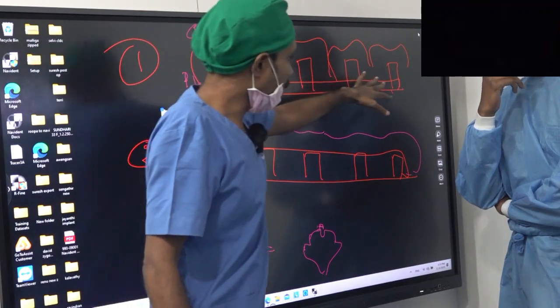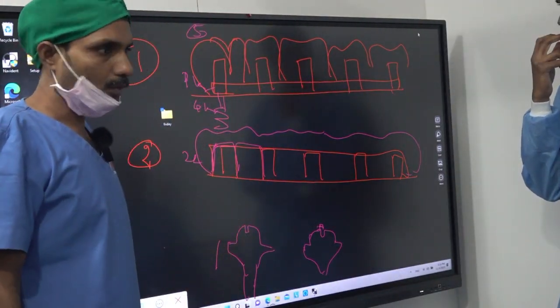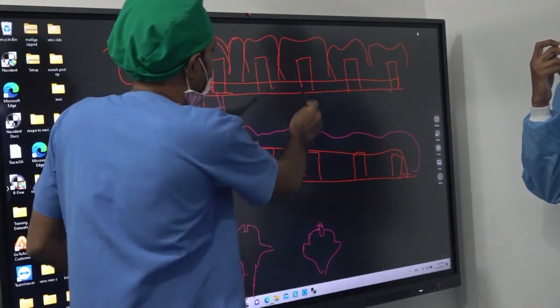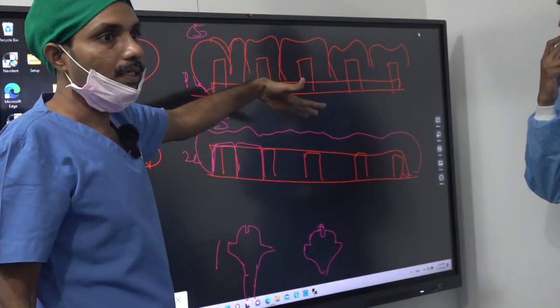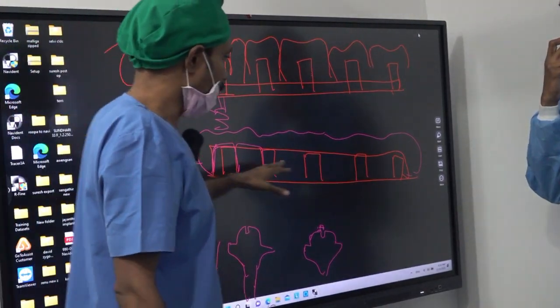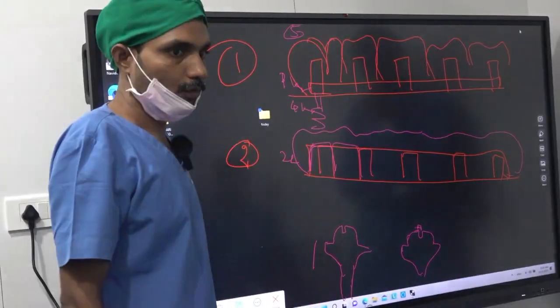If the implants are all good, the welding works. There is decent bone, and inter-implant spacing is also decent. But if one implant is here and another implant is here, and the inter-implant distance is long, then welding may lead to failure, because the wire flexibility increases. So you may have to go for a metal acrylic. Okay, it distributes the forces better.